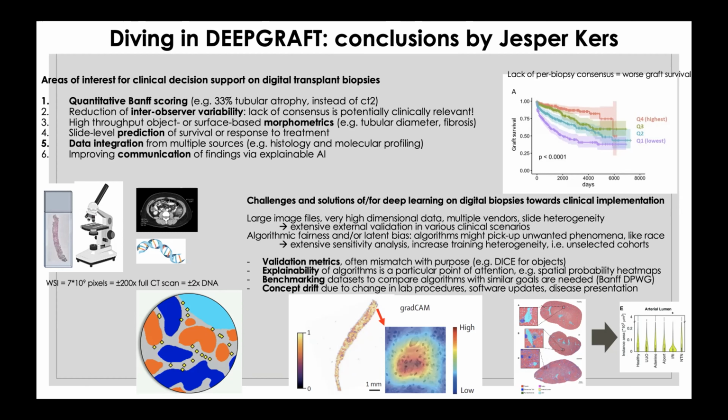No worries. I just thought I should show this again and orient people, but I think most of the people on the call were actually there, and they really thought a lot of this study, and some of the people have even been involved in the study, looking at how to segment the biopsies, how to give virtual Banff scores and things like that. I really liked what you said about the DICE measurements, and not just looking at overlap, but looking at the number of things that you segment in there, and I thought that was a great observation.